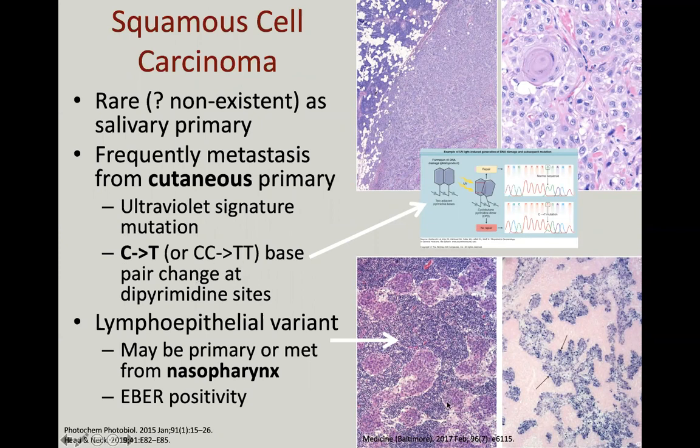If you have a tumor that looks almost like a quote unquote lymphoepithelial carcinoma with very non-keratinizing morphology, with lymphoid stroma, think about it coming from the nasopharynx or oropharynx. So think about doing your EBV. Think about even doing your HPV, although these are going to be less frequent than just the classic keratinizing skin cancers. All right, but anything is possible.